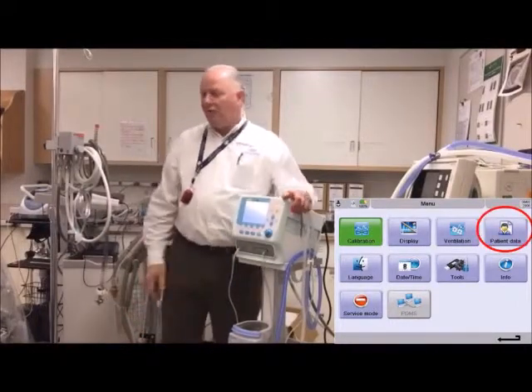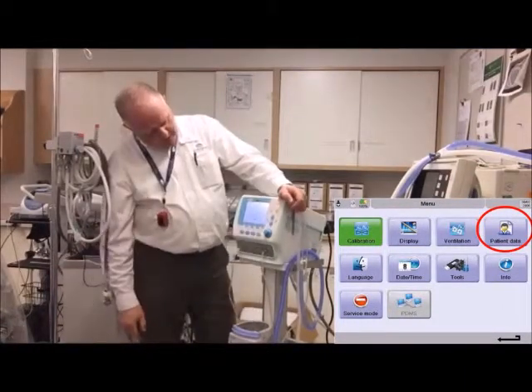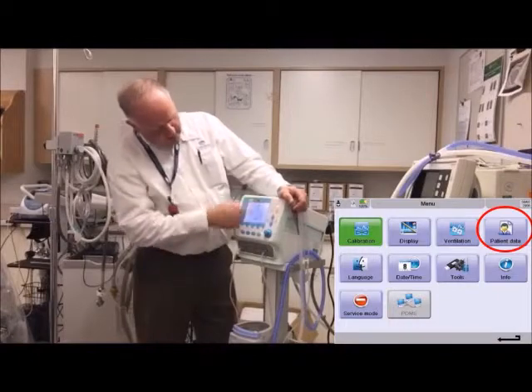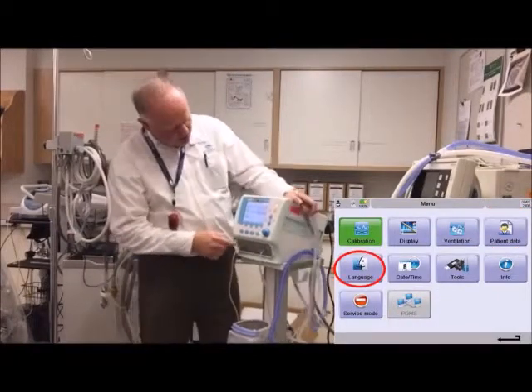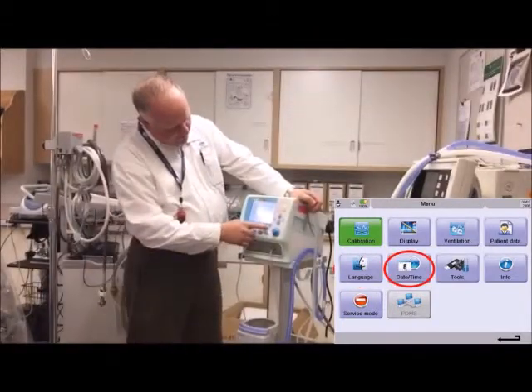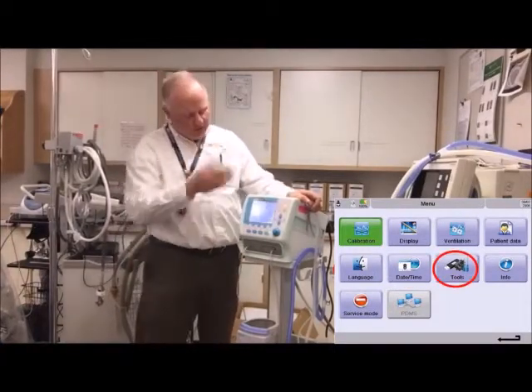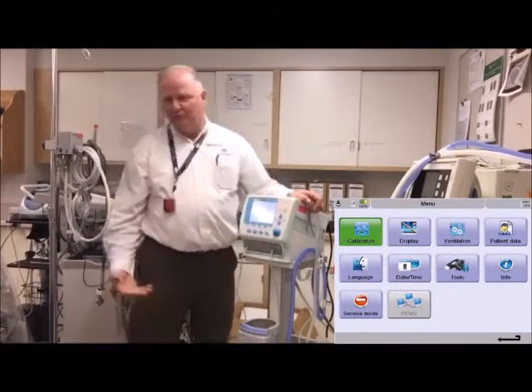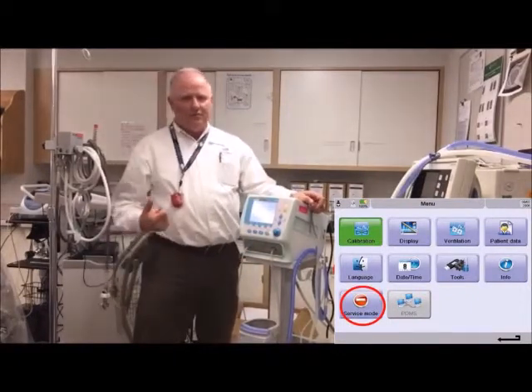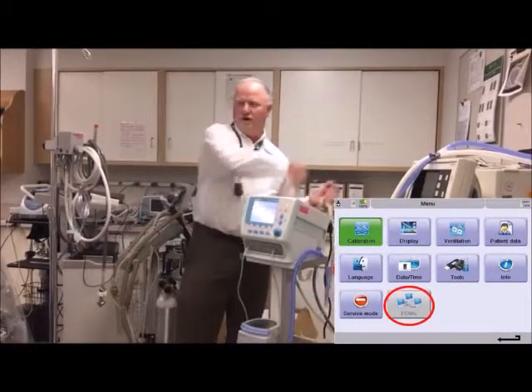There's patient data — I don't think you'll be using that in the near future. When you turn the vent off, it'll likely delete those anyway — double-check the manual on that. You can change the language: English or, as it says, American. Date and time have already been adjusted for you. You can download trends and alarms to a USB stick. You can also see the software version, hours of use, and so on. There's a biomedical access menu and one for connecting to your electronic medical records.